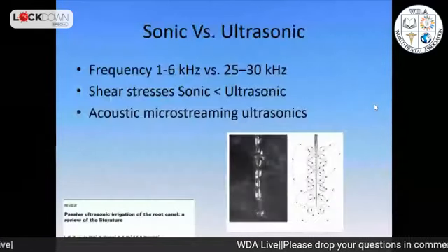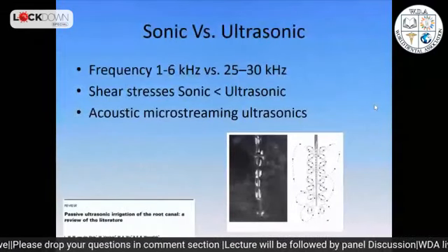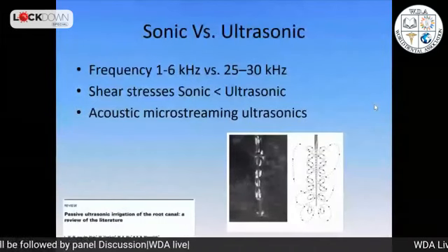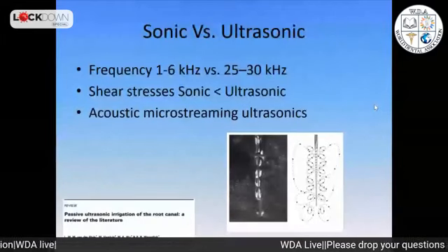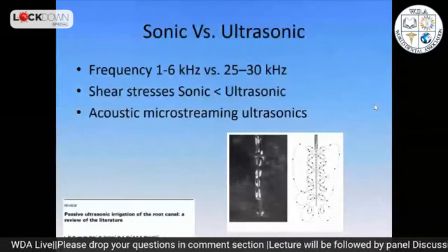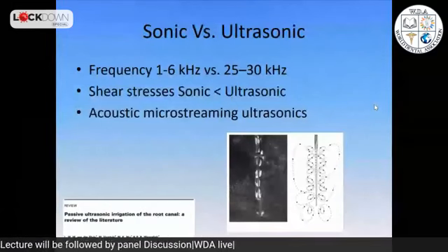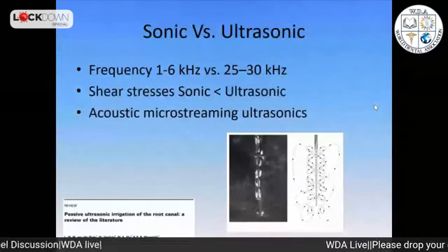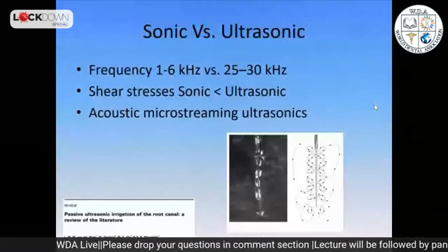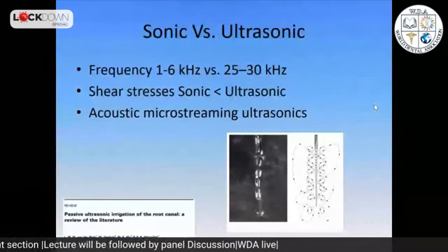Now, there is a lot of discussion: do you use sonic or ultrasonic? This is something where there is a lot of inconsistency in the literature. There will never really be a full agreement, and there are differences in frequency and in the sort of stress that will have more action over the biofilm and over the debris in the root canal. And apparently, or it is suggested, the ultrasonics will cause this sort of dynamic, so you will have a larger circulation with some smaller areas of circulation, which is called acoustic microstreaming.